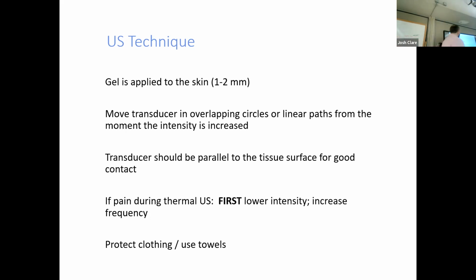The other thing we want to do for our patient is protect. We want to have towels because we're going to need towels to wipe up the ultrasound gel, but we're also going to be tucking it into any clothing to make sure we're protecting the clothing of the patient. We don't want you walking around with ultrasound gel on your shirt all day long. It's no fun.